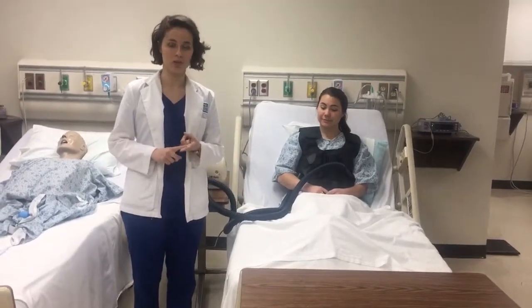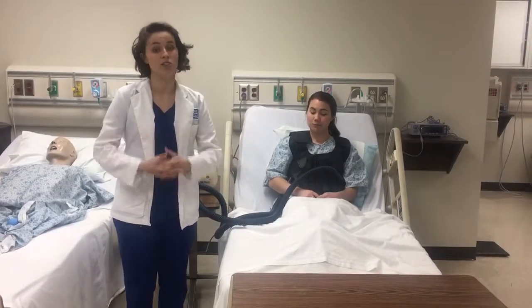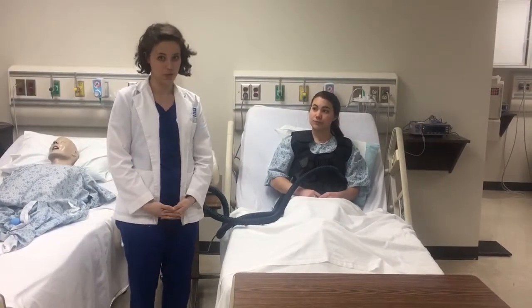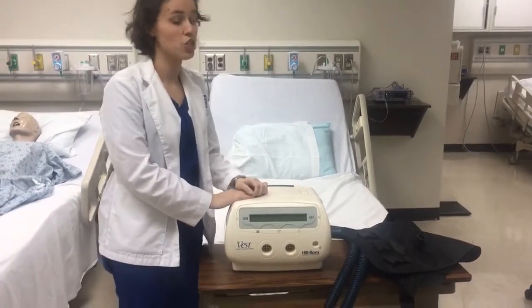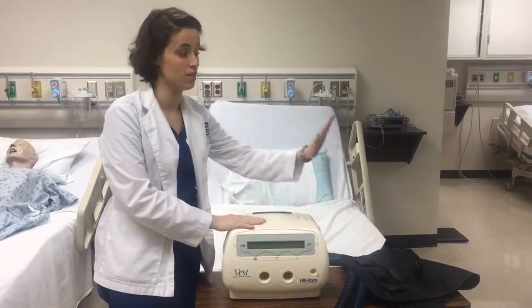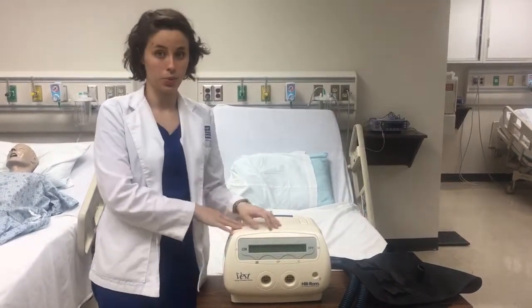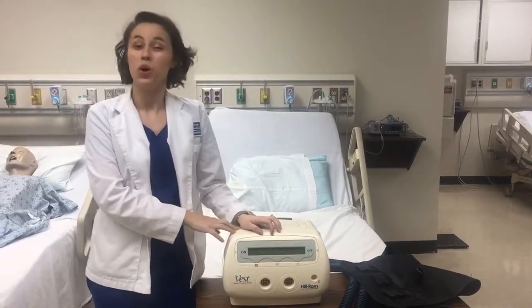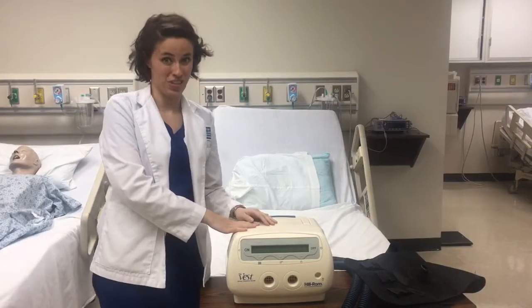Once you have evaluated the sputum, complete the assessment as you did before beginning the treatment. Check for pulse, respiratory rate, and breathing pattern, as well as mentioned before, the cough and sputum production. Once you have completed your therapy, make sure to disinfect all the pieces of your device, especially if you'll be using the same appliance in other rooms. And don't forget to document your use and assessment of your patient.